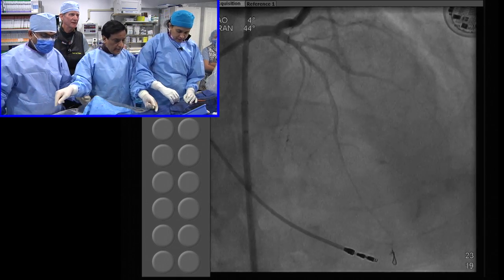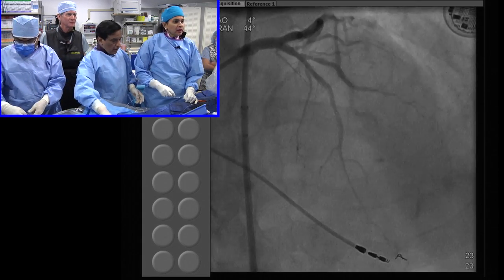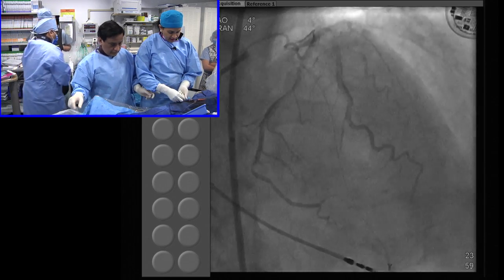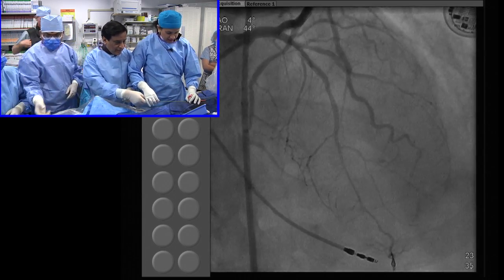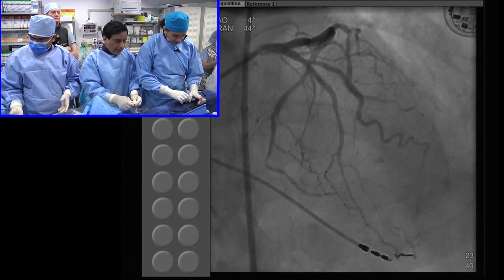In this angulated, calcified, small vessel, buddy wires, let's go to the guideliner, the main work that we wanted to do. 3.0/28? Yeah. Good. So a tip, which we have also learned now, is that there is big temperature control. So where they are stored and how they are covered are very important.